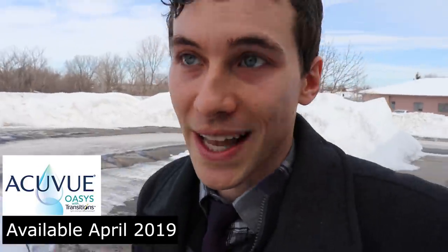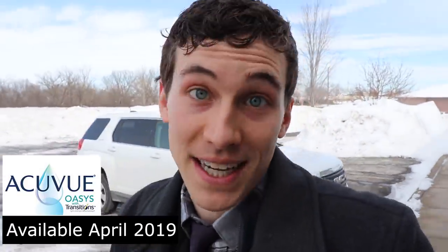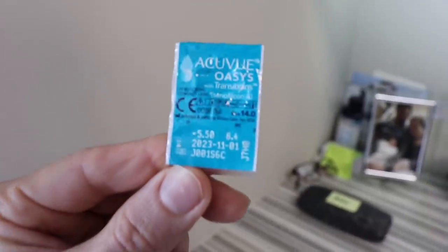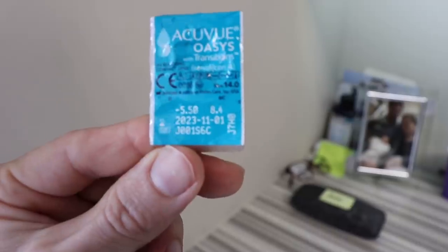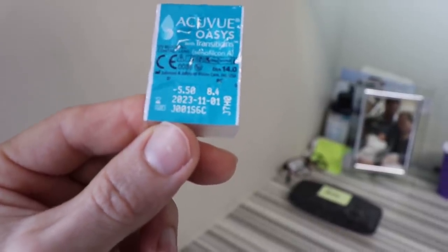I'm going to be putting on the new AccuVue Oasis with Transitions lens. It comes out on April 1st here in 2019. Currently, I'm wearing my other contact lenses, but I'm about to head into the clinic so we can put them on for the first time. Here's the AccuVue Oasis, just in the blister pack. It's an 8.4 base curve, a 14.0 diameter, and it's in my prescription of minus 5.50.